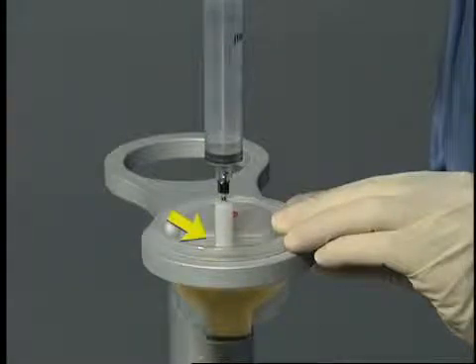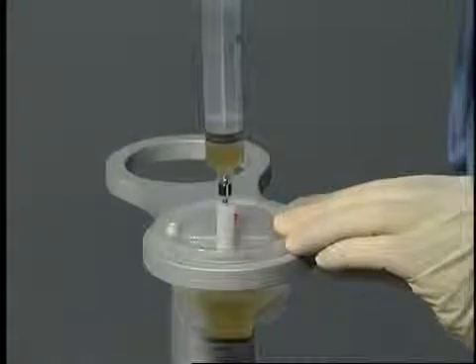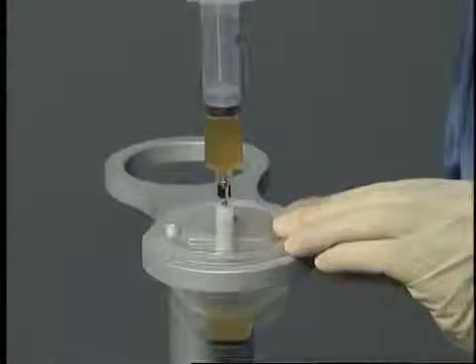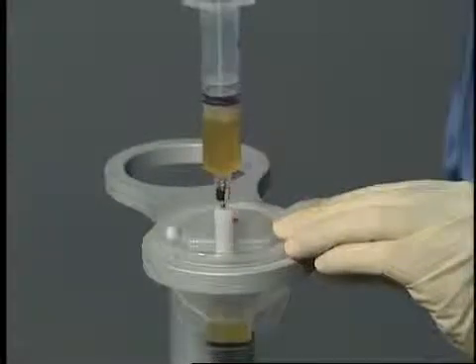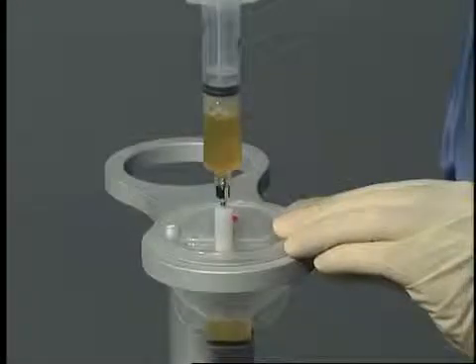Push the cannula down until the white spacer guide is firmly seated against the white port. Withdraw the platelet-poor plasma volume from the plasma chamber until air enters the syringe. Approximately 3 milliliters of PPP and platelet concentrate will be left in the process disposable.